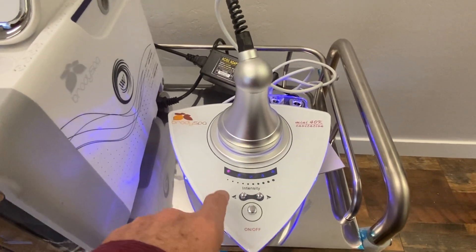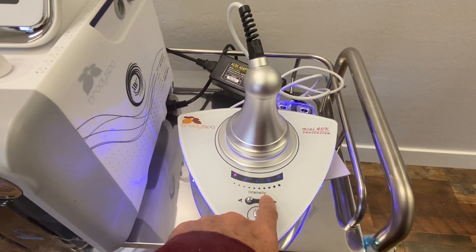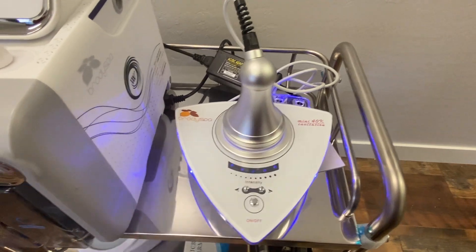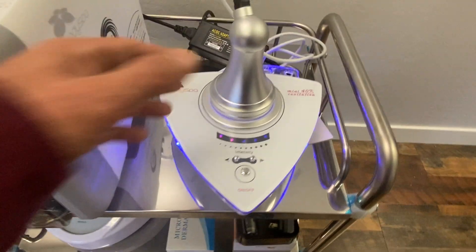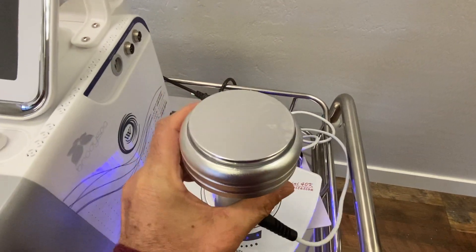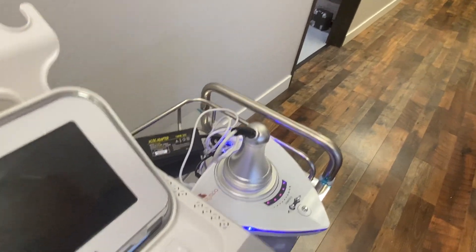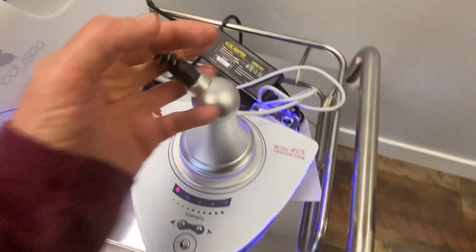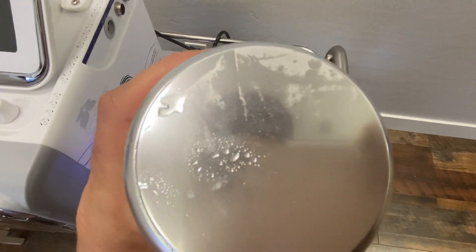You'll see it beeping, and you want to increase your intensity, and then you should see this incrementally go up to that intensity. That's when you know it's working. You can take a little bit of water and actually test it — as you can see, it's reacting to the water.